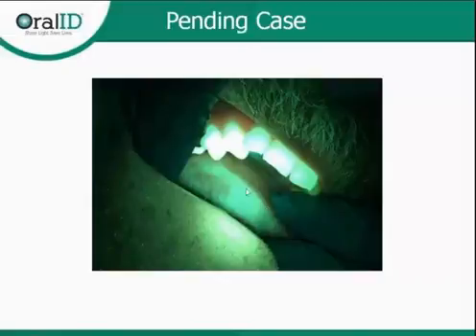But here the doctor had not seen anything for a long time, and then he finally finds something, and I think he was just caught off guard, and he didn't know what to do with it. So he told the patient, I think I see something, but I'm not sure. I'm going to call the company. I'll give you a call tonight. So he called us and said, I think I found something. What do you think? He sent in the pictures. I said, yeah, I think you found something, but what does something mean?